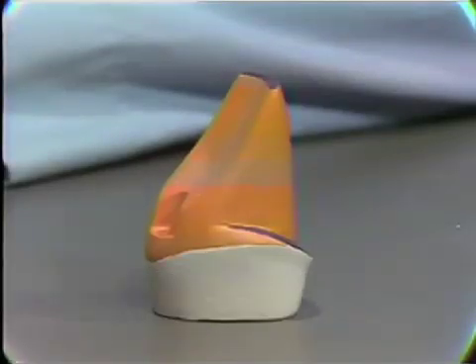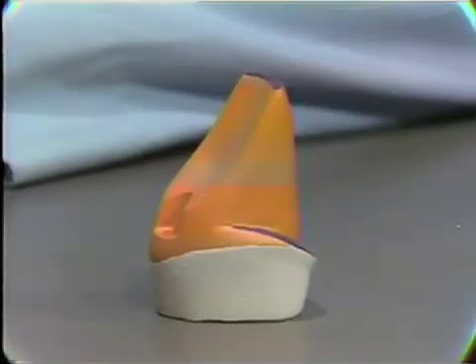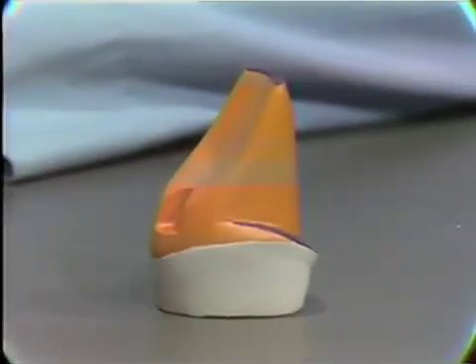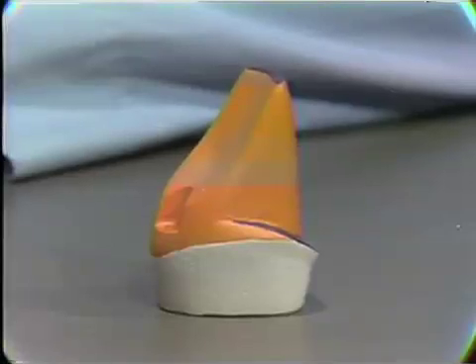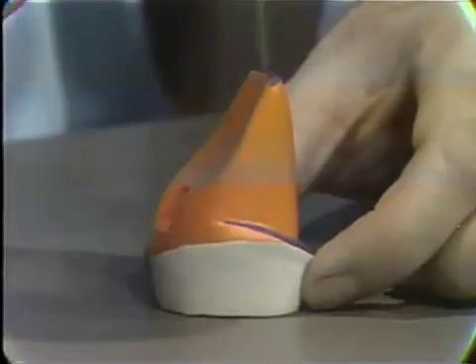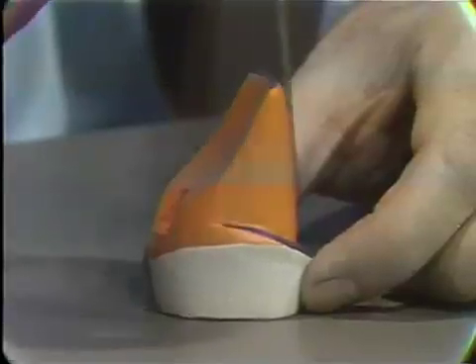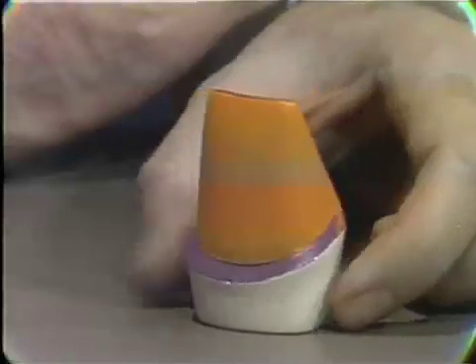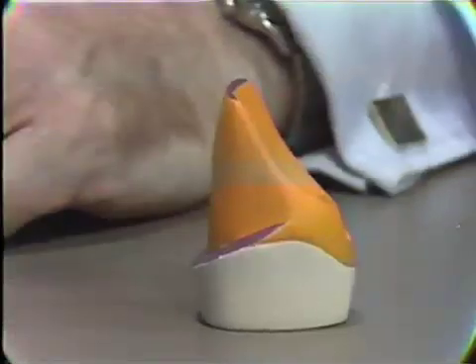The Veneer Crown retainer is used, of course, on both anterior and posterior teeth, wherever aesthetics is critical. And the particular model we have here is of a preparation on an anterior tooth, a maxillary incisor tooth. The complete crown preparation, which this is, of course, is one which gives maximum retention. As you can see, the areas involved in retention are at a maximum here. All of the axial surfaces of the preparation participate in retention and anti-torquing activity.